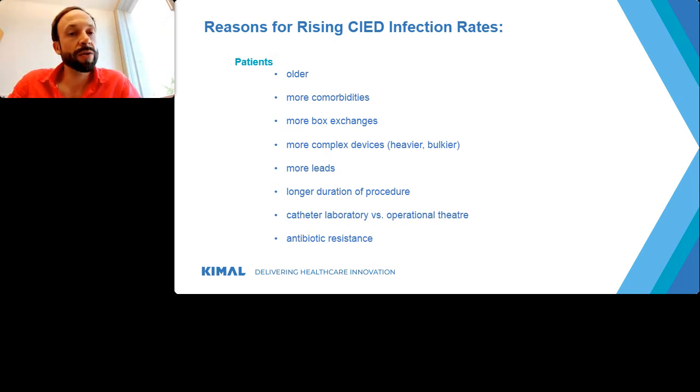Therefore, they need a longer duration to be implanted or handled. And if we cardiologists conduct the procedure, we are more likely to conduct this in the EP or the catheter laboratory rather than the operational theater, which is a different kind of setting in terms of sterility. And I suspect a shift in antibiotic resistance in endemic species.